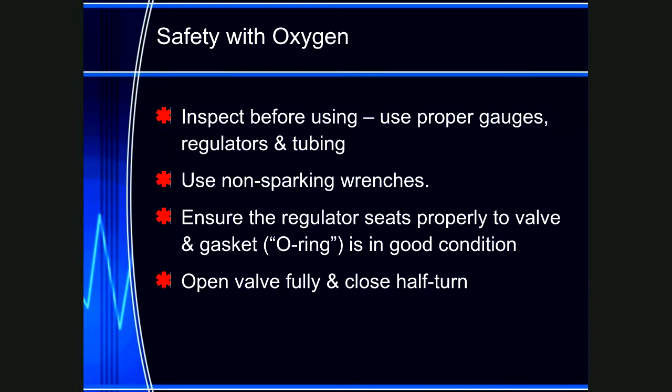Some people will open the cylinder just a half a turn. Well, are you going to get oxygen out? Yes. But the problem is, you turn it a half a turn. What if something bumps it? Now it turns it off because it's only a half a turn. Whereas if you turn it open fully, you're going to have to go around 3, 4, 5 times to get it to shut down. So you take the chance of hitting it and shutting it down out of the equation.